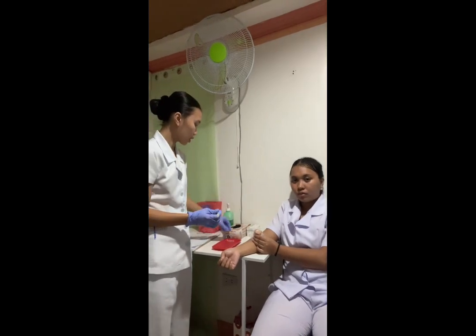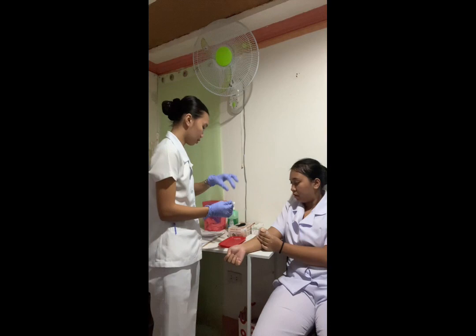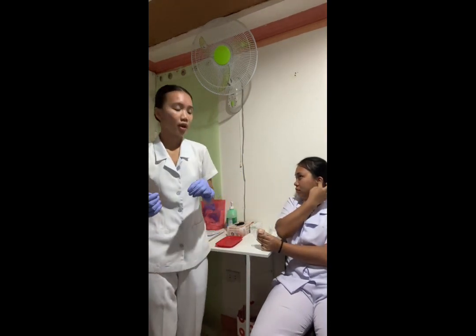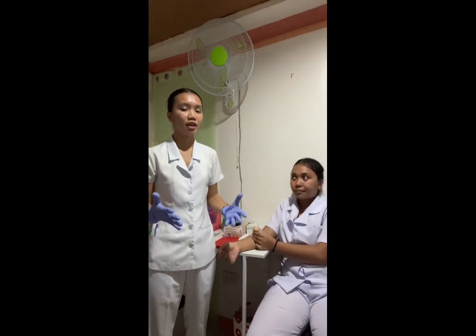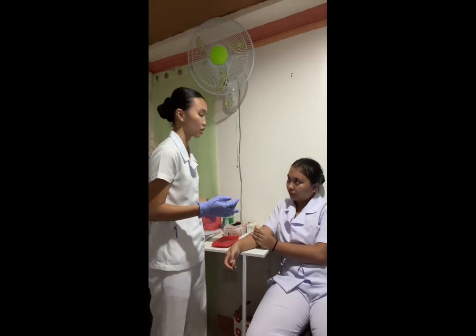Because slow needle withdrawal may be uncomfortable for the client, and so with this we are going to dispose of it. And then we should not massage the area or the injected site, because massage can disperse the medication into the tissue through the needle track of the injection site.